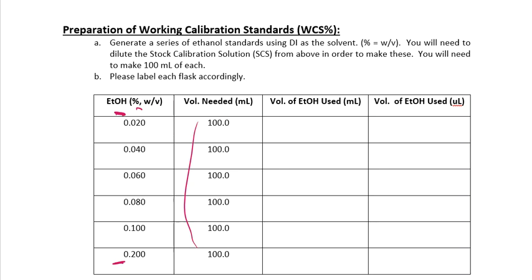and in the two blanks over here to the side, you're going to see the volume of your ethanol that you should be using. And how does that equate to microliters? You won't need to use a micro pipetter here. I think the volumes are big enough for you to use a glass pipette, which is why we are making you do the concentrations we are listing into the lab, so they're workable, things that you can manage with a glass pipette.